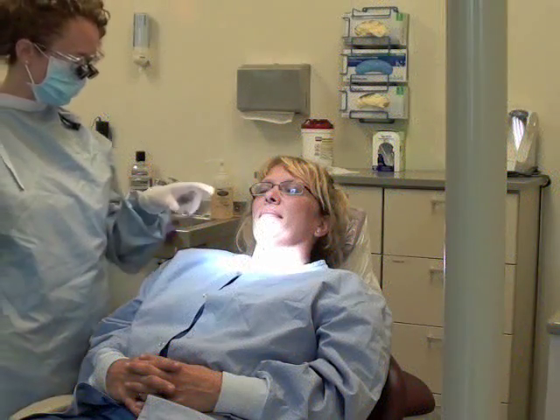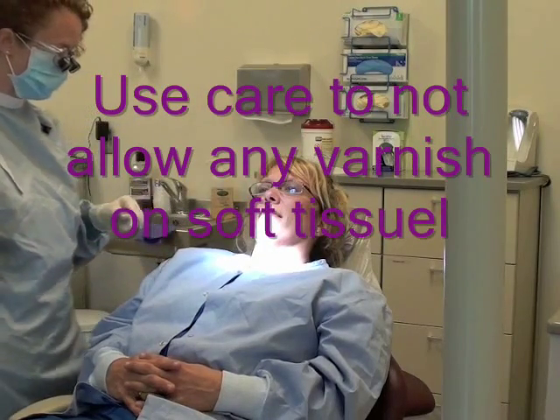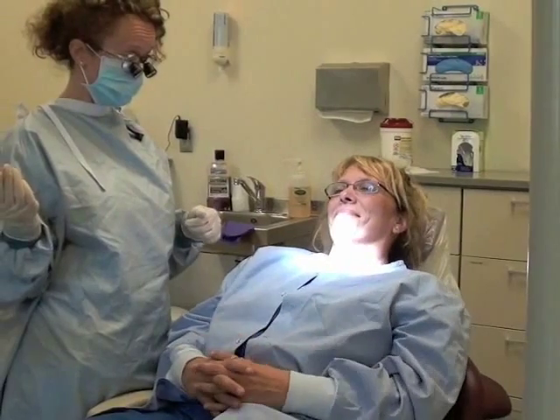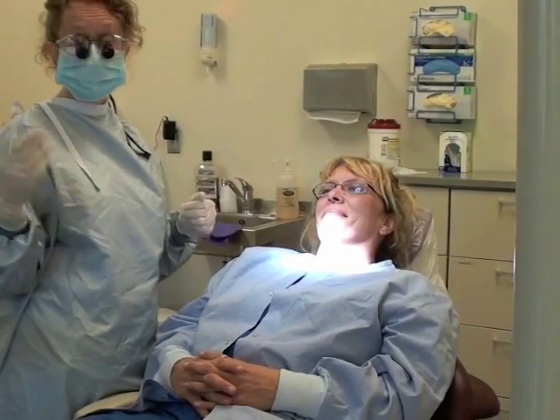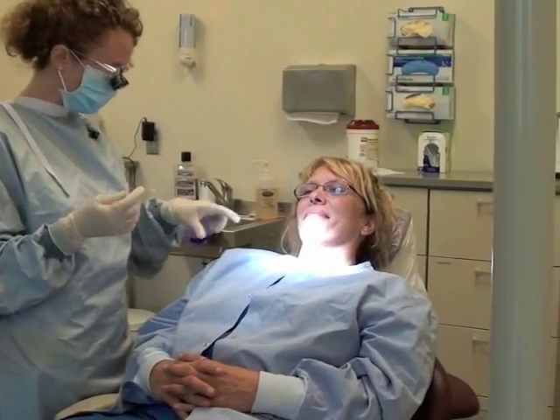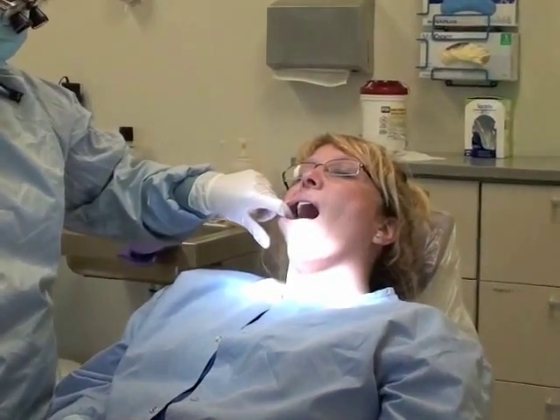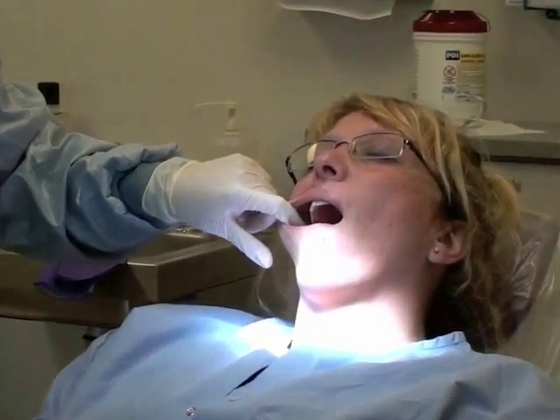I'm going to apply fluoride varnish to my patient after her prophylaxis, although a prophylaxis is not necessary in order to apply fluoride. Just make sure that all the organic material is off the teeth if you're not going to do a prophylaxis ahead of time.